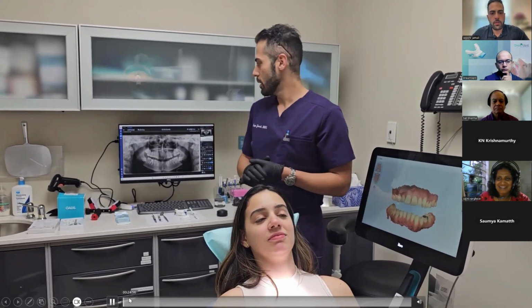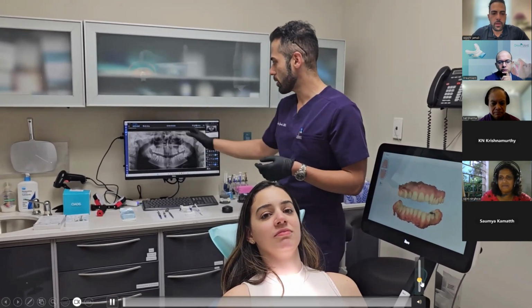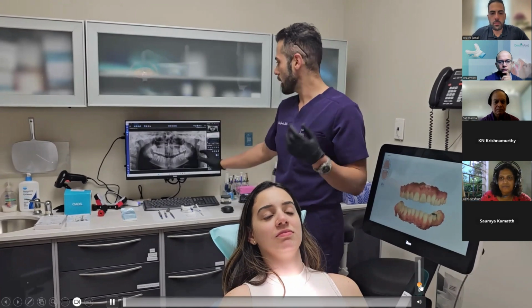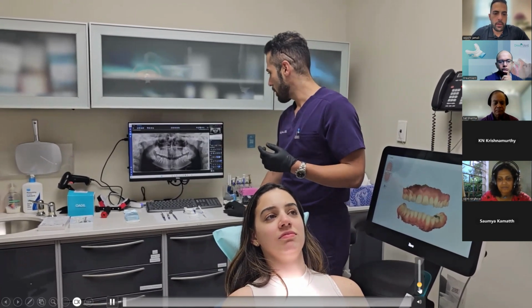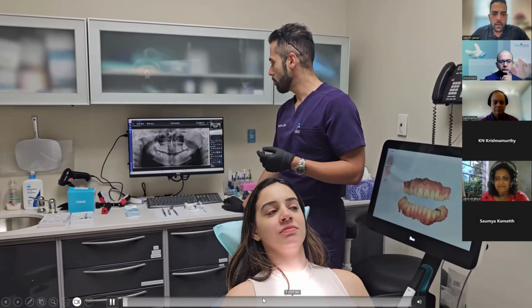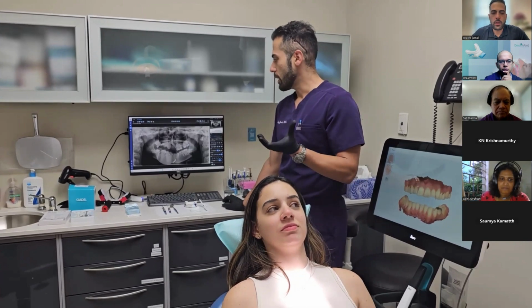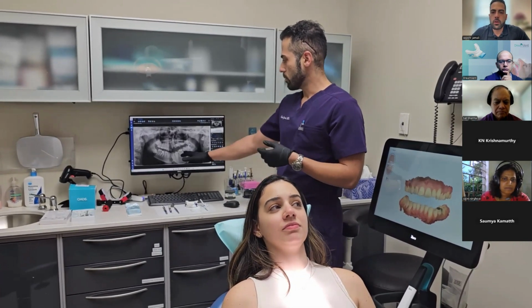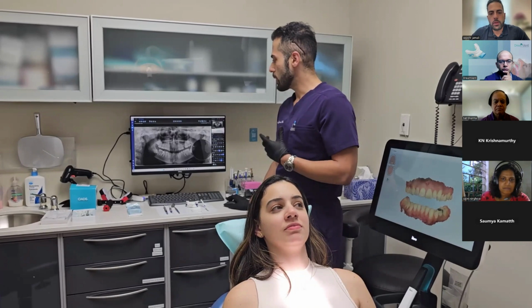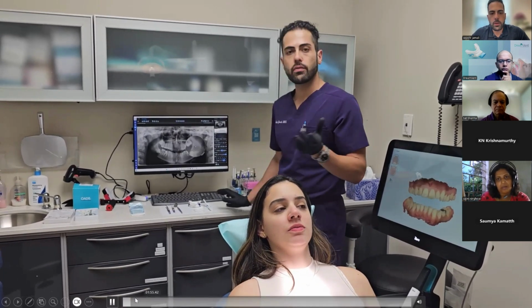So as you see, we check the panoramic X-ray. We check for any type of extreme bone loss or any major treatment, like this patient has a retained 7.5 that doesn't have any root left in that. We also check the TMJs to see any signs of extreme erosions or malpositioning of the TMJ. We can also see if there is any deviation in the nasal septum.